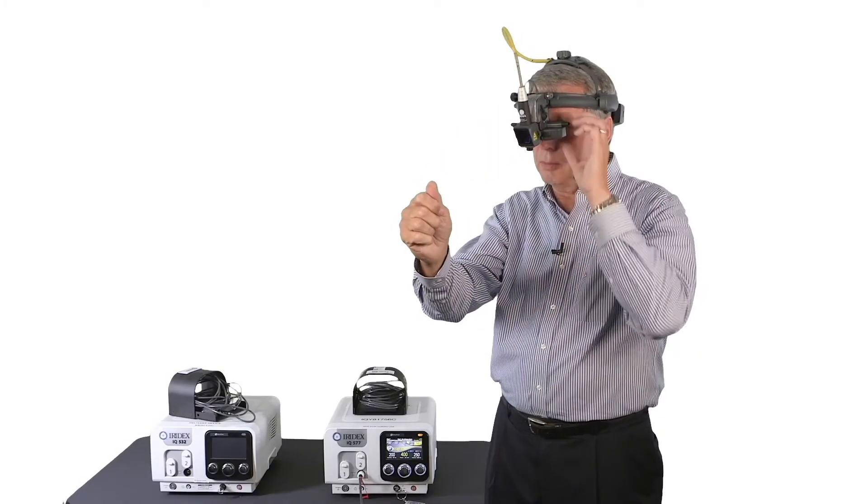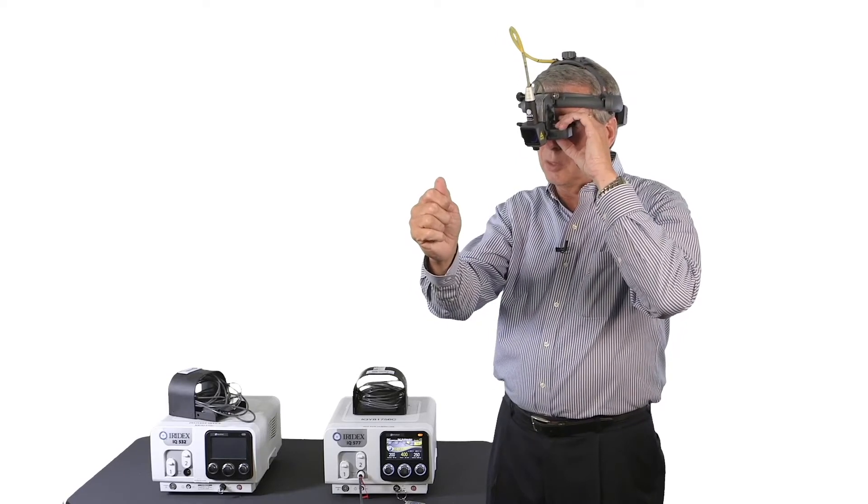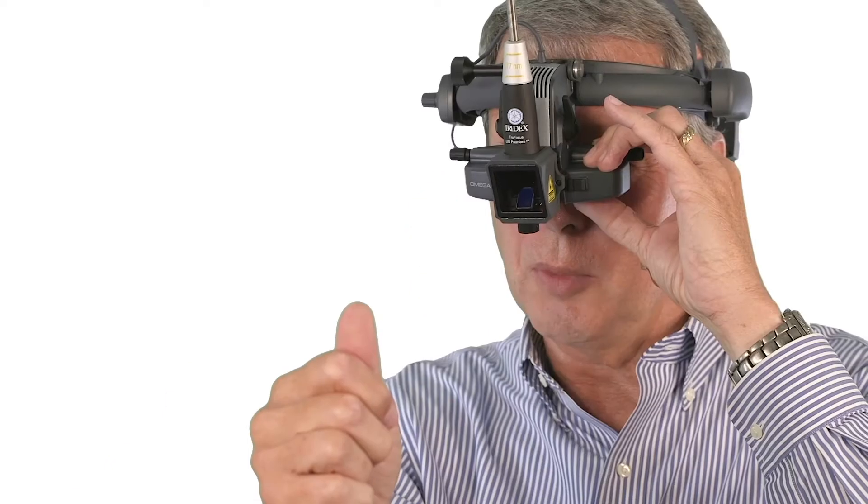Doing just the opposite, close the right eye, adjust the left ocular the same way. At that point, if it's properly adjusted, you should be able to easily read print at about 15 inches.